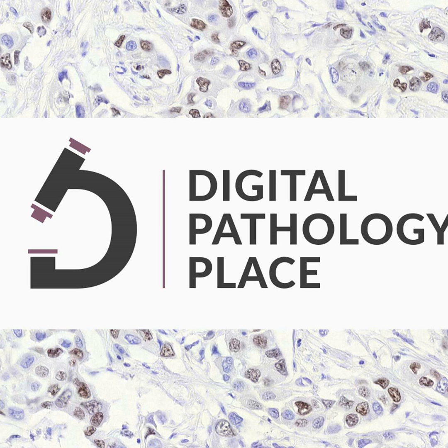But if you look at multiplex immunofluorescence, it comes with higher plex over time. Once you get to 100 plex, you cannot do 100 plex on every patient. You have to narrow it down to actionable panels. So this is where it's extremely critical.